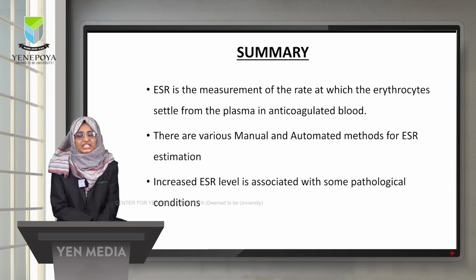Summary: ESR is a measurement of the rate at which the erythrocytes settle from the plasma in anticoagulated blood. There are various manual and automated methods for ESR estimation. Increased ESR level is associated with some pathological conditions.